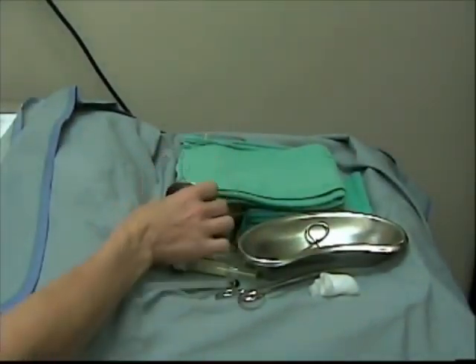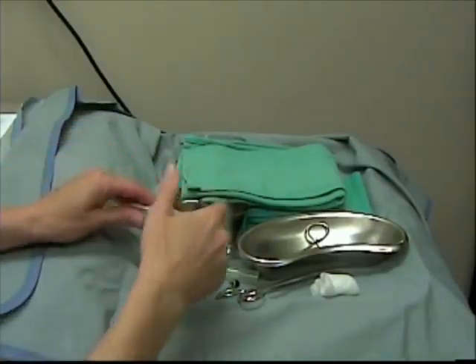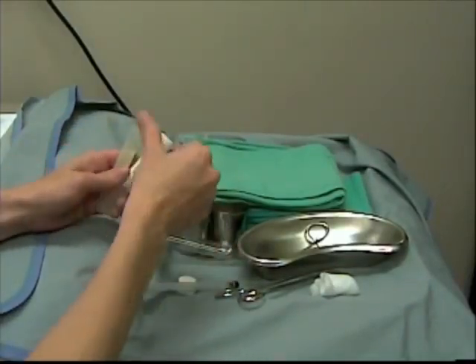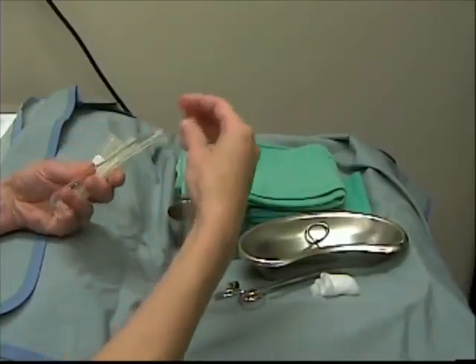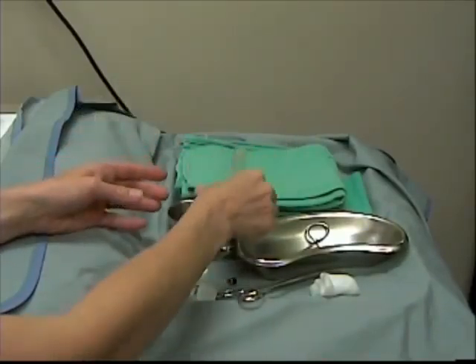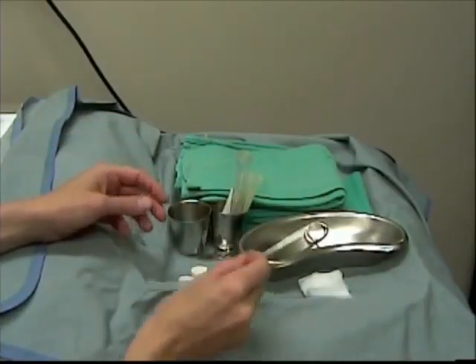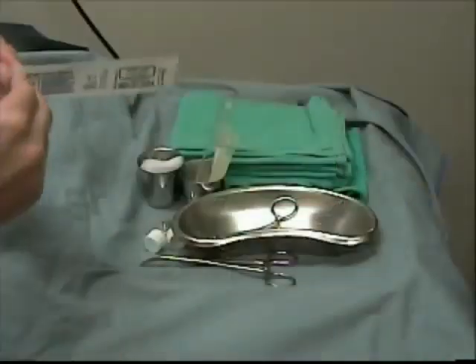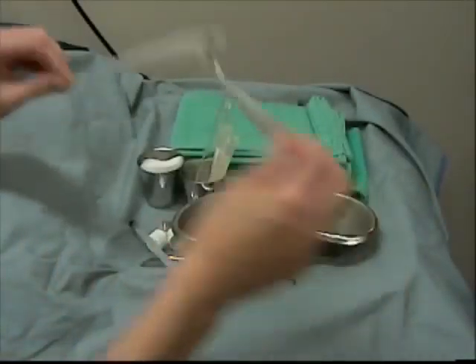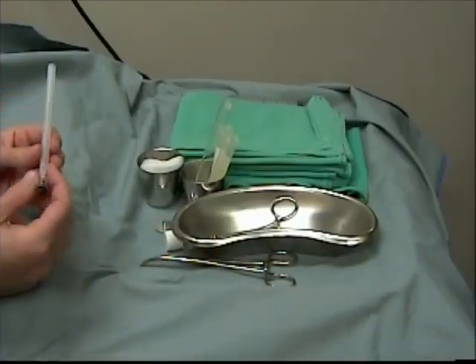Your equipment will come on a reusable or a disposable tray. Your tray will contain drapes, several containers, gauze, and a few basic instruments. Often it will have tubes. If not, tubes must be placed on your tray prior to beginning the procedure. Tubes should be opened before you begin to facilitate filling once you have successfully obtained CSF flow. Open your needle and place it on the tray. It is important to note that there is a stylet within the needle.